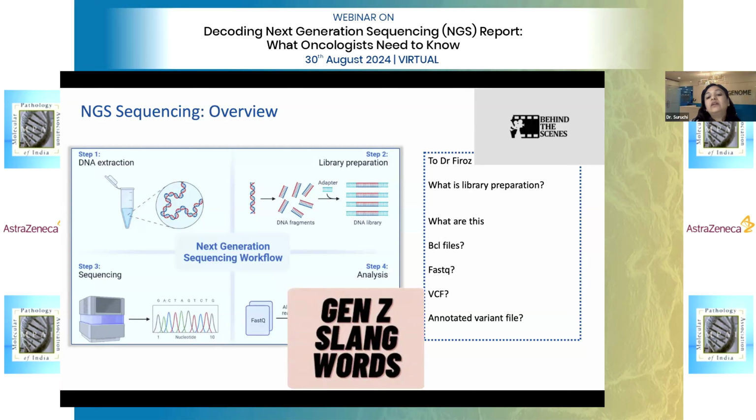So there it can be a little variability based on how you are looking at the variants. For variants which are well defined in the literature, usually variability is not there. However, for variants of uncertain significance, where the literature evidence is not there or we don't have much information, that variability can be there, so some labs may report a VUS or some labs may report differently, based on the analysis or interpretation of that particular variant.